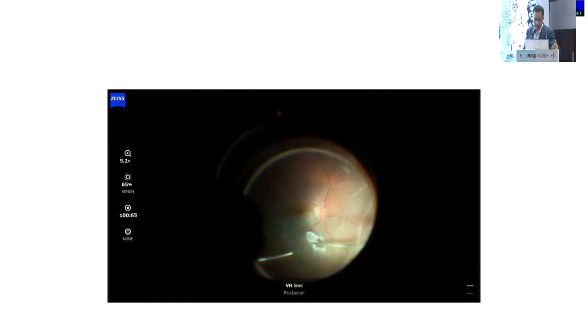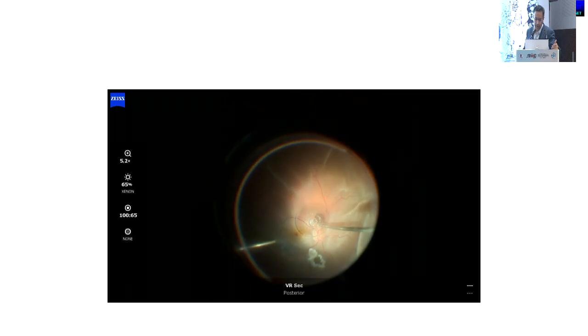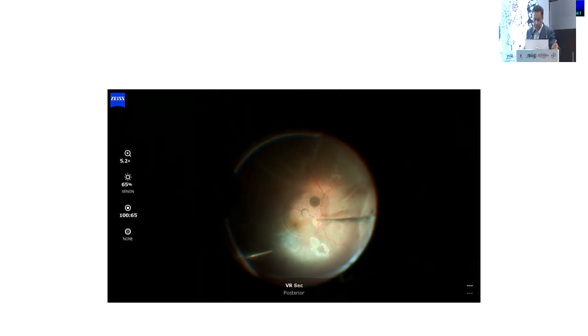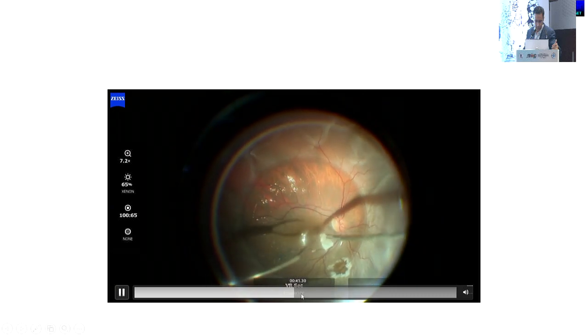And then we cut it till we have a little bit still attached so that it doesn't fly off. And then the idea is to put a PFCL bubble which covers this and then drag it under this over the macular hole.